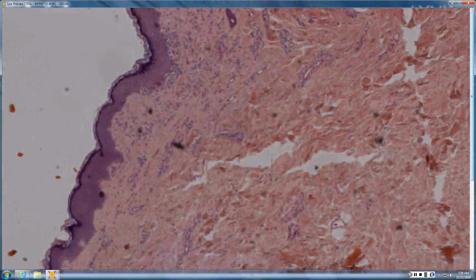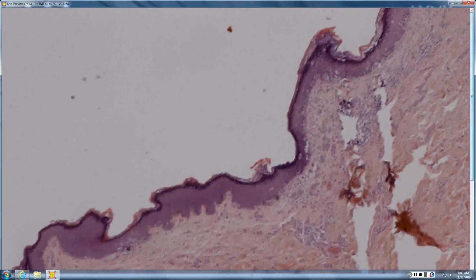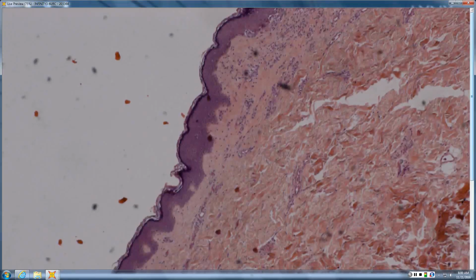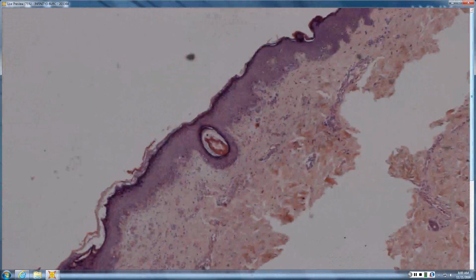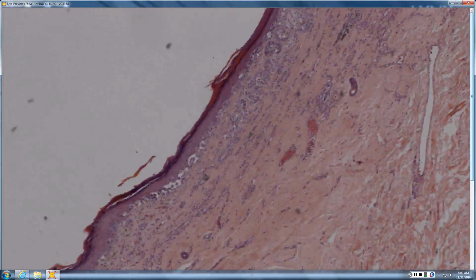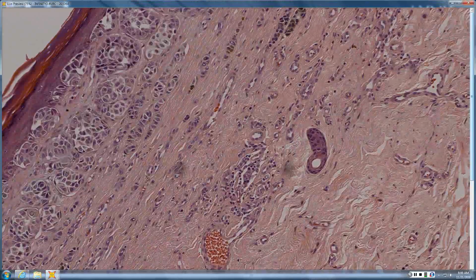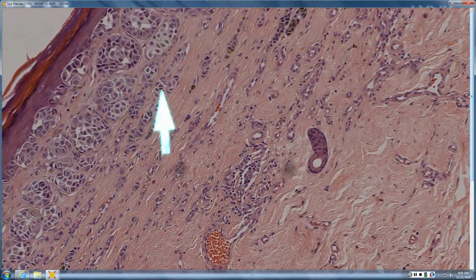Okay, should we just go around? Sure. I thought this was melanoma. One, context clue being the breadth of this excision. So that would be one hint. The physician's intent was certainly something broad here. And then two, the irregular nests of melanocytes packed together. And there is a parallel pattern of the nests where they go parallel to one another within the dermis, which is typically a melanoma pattern.